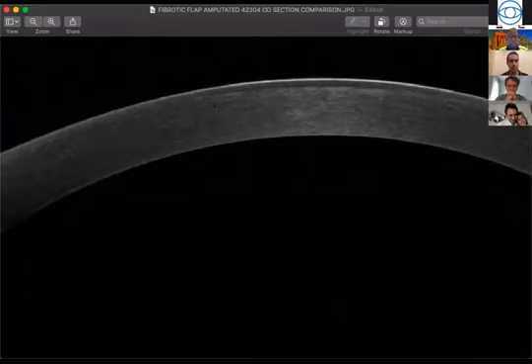It's a pretty homogeneous cornea with still good thickness, but it's very difficult to judge when you still have doubt whether this is epithelial ingrowth. Your image was very clear; my image was completely different. It was fibrotic reticular haze, which you were able to see along the flap. But your image is impressive, to see that all of this epithelium was not in the interface. I'm very surprised to see that. Exactly.